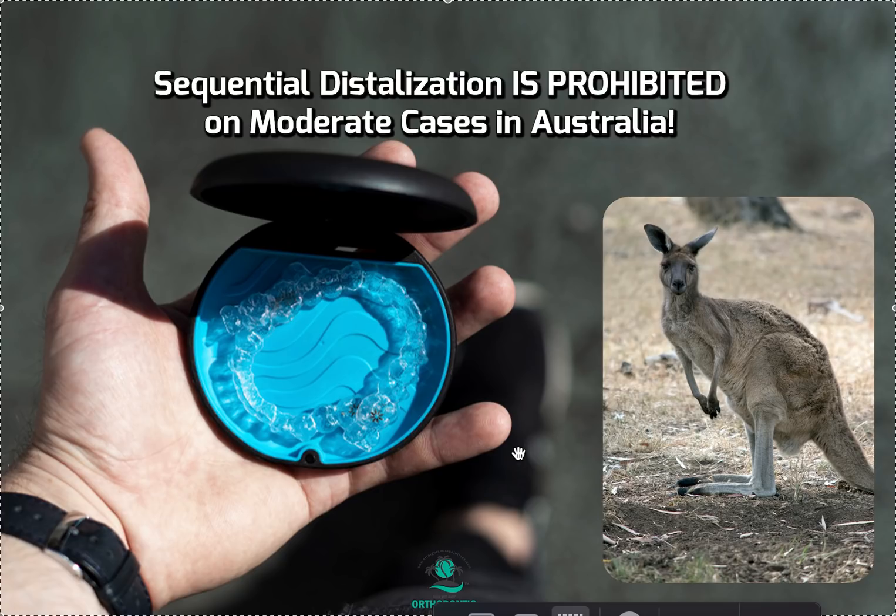But anyways, yeah, it's super predictable, because let's say you have like a slight class 2, 5 millimeters overjet, okay, kind of case. What are your options? Well, let's say the patient isn't growing. Well, then you could put buttons on and do elastics, but that's not super predictable, super compliance-based. Outcome can be really variable. So it always has at least 1 or more refinements, right?